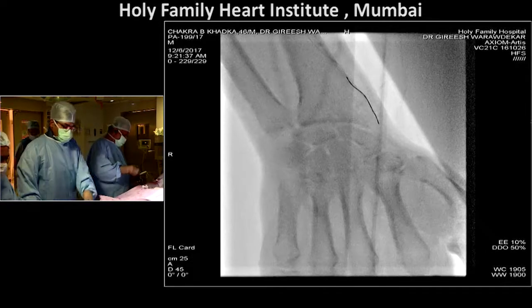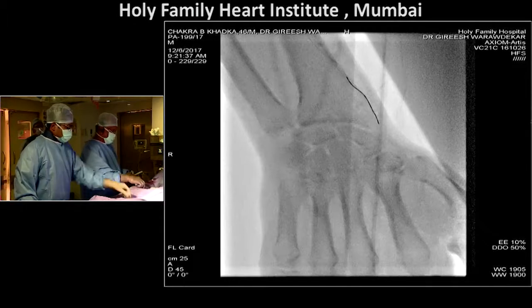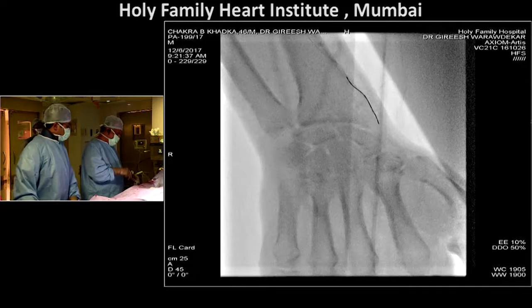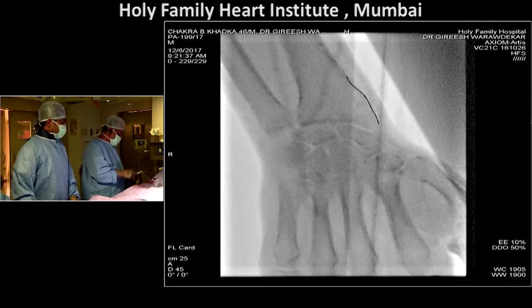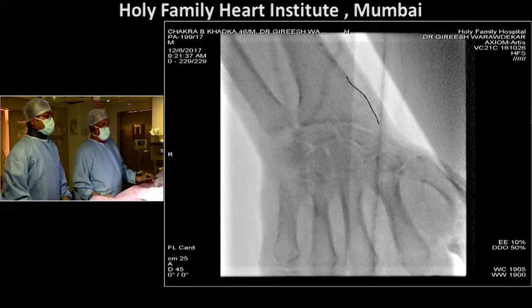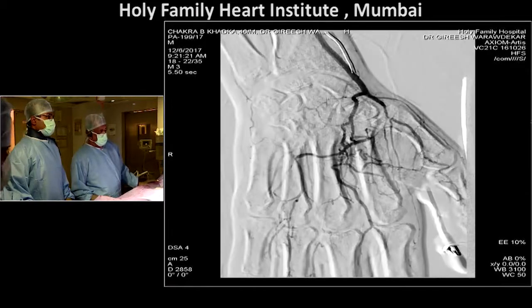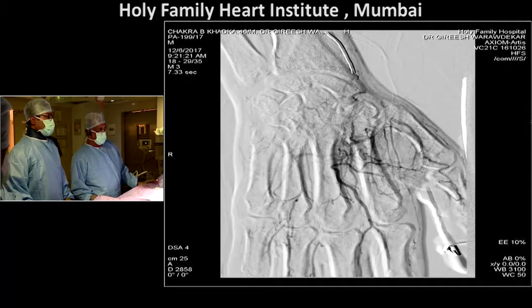No, Vimal, that is accepted. But okay, the most important thing is, what are we using the drug-eluting balloon for? For preventing neointimal hyperplasia. Yes. Here we have a chronic thrombus, so obviously there is no role. Yes. Did you see the shoot afterwards now?